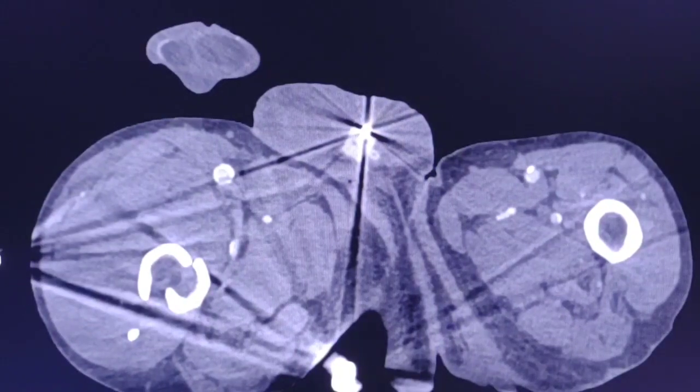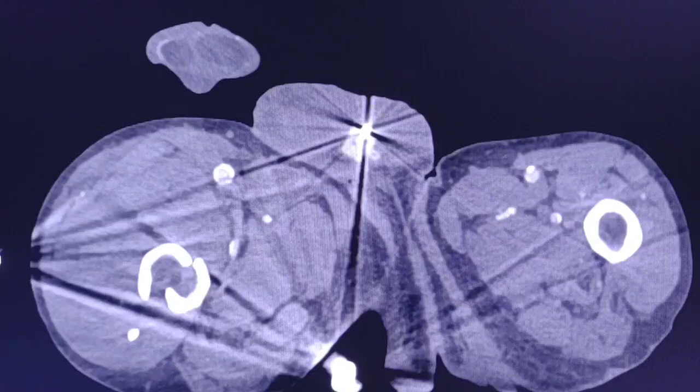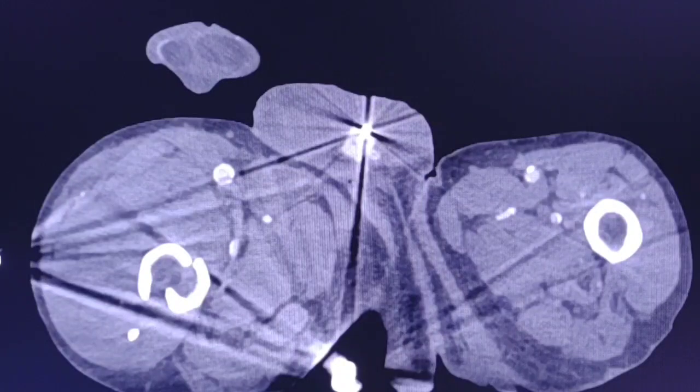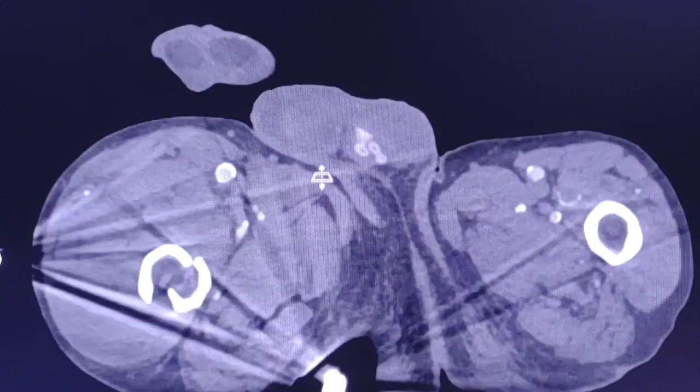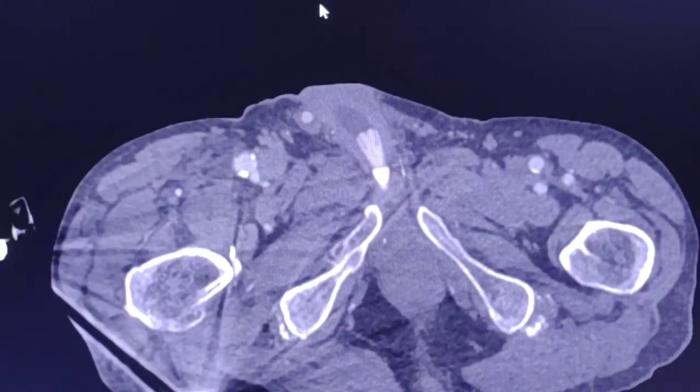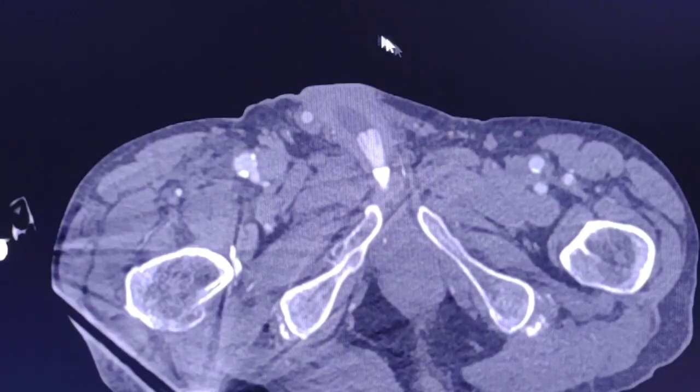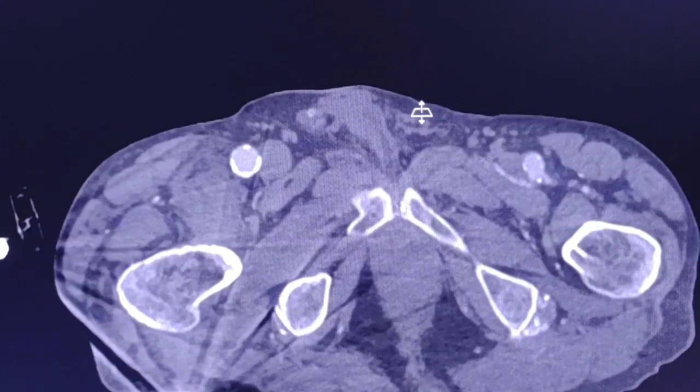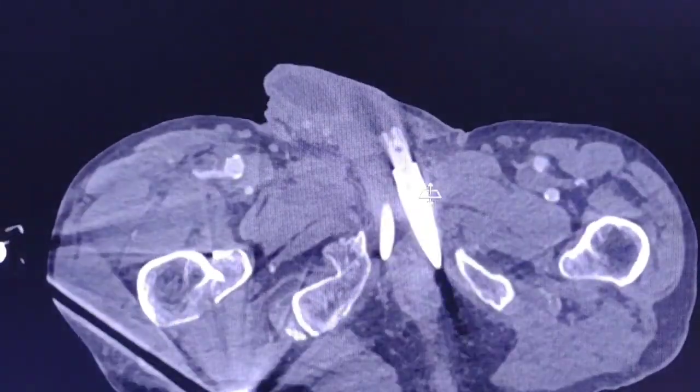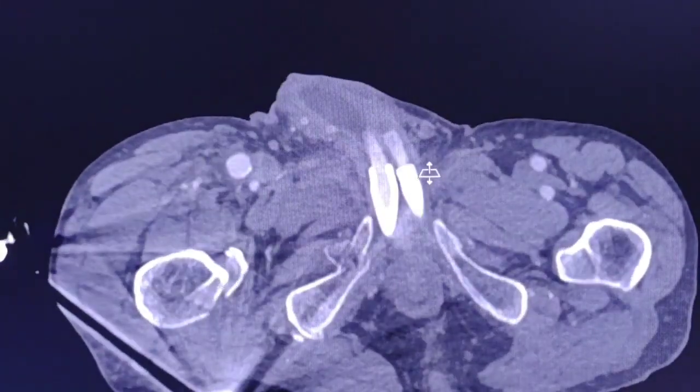And the most common are leaks around the tubes or the reservoir with subsequent infection. We can see some free fluid in the lower pelvis, for example, or some inflammatory process very close to one or more of the components of the device.